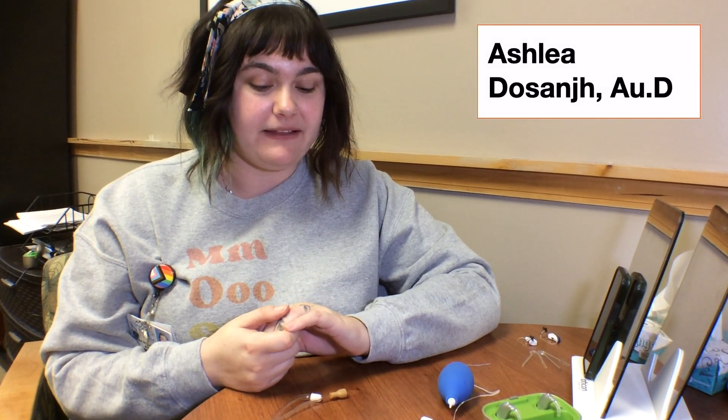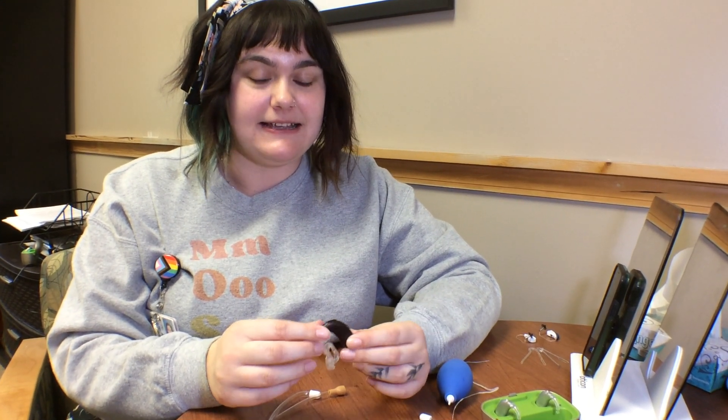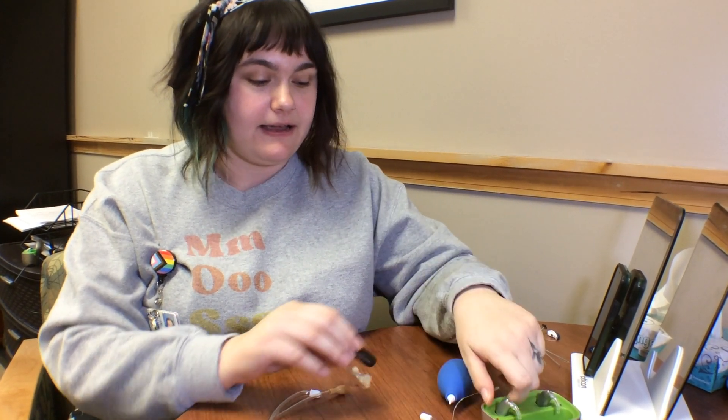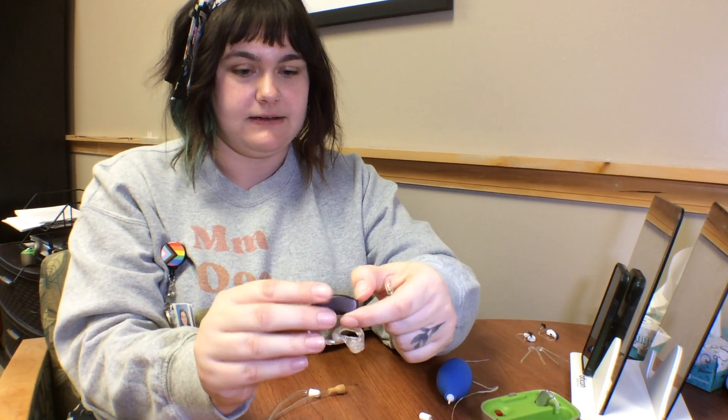I'm Leah Dessange. I'm an audiologist and we are performing a listening check today on the BTE style of hearing aid. BTE is behind the ear. They come in rechargeable and battery driven.